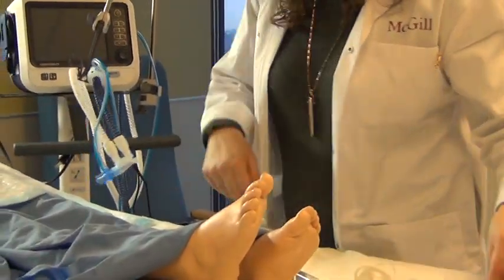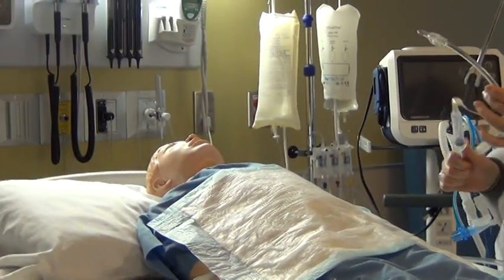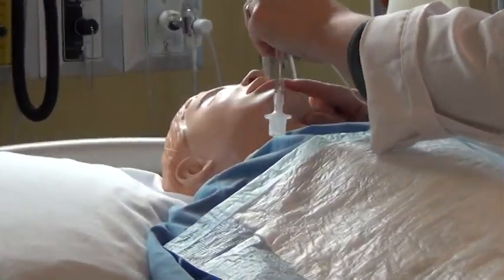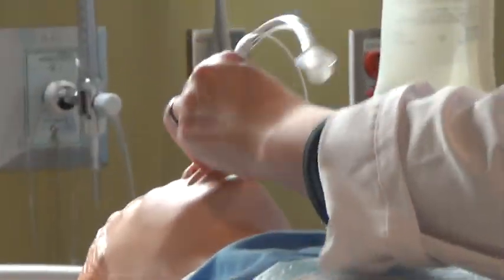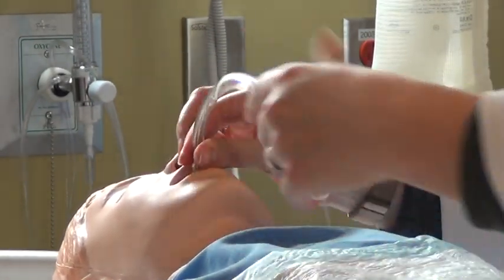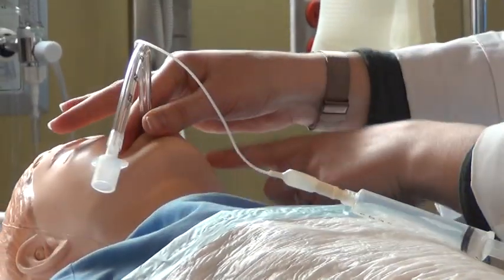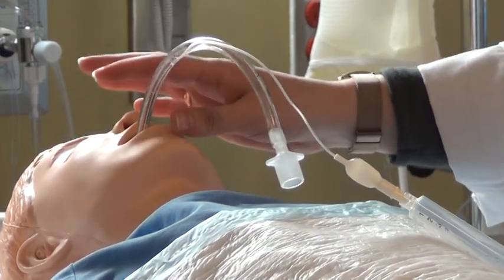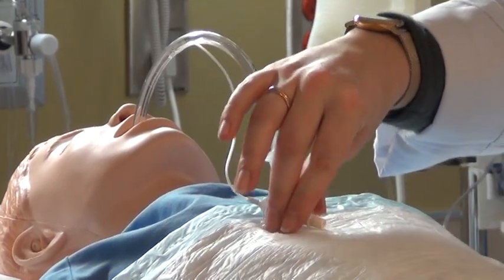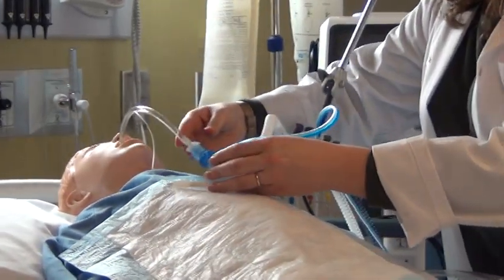Now, when the endotracheal tube is inserted into the mouth, this is done by physicians, or it could be inserted by a respiratory therapist. So we will just partially insert it for the purpose of this demonstration. And then this would be taped around and around the face just to secure it in place. So once this is connected, the balloon would be inflated. We would remove this syringe, and this would be connected to our ventilator like this.